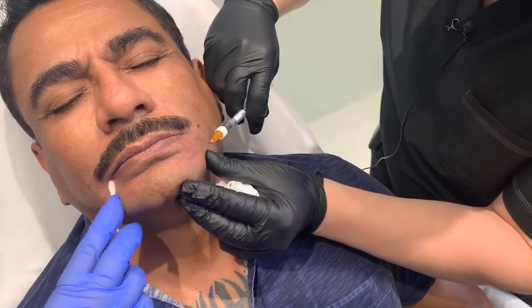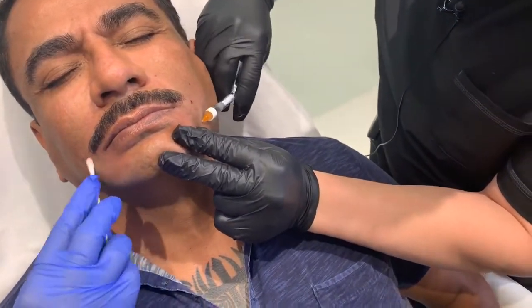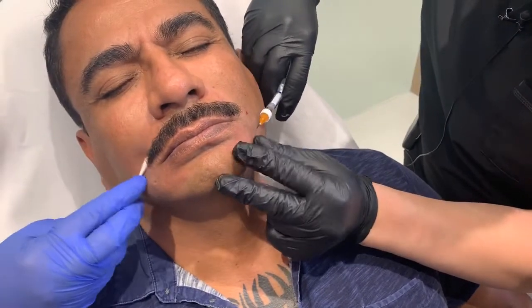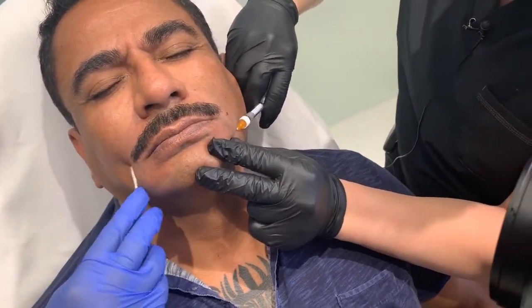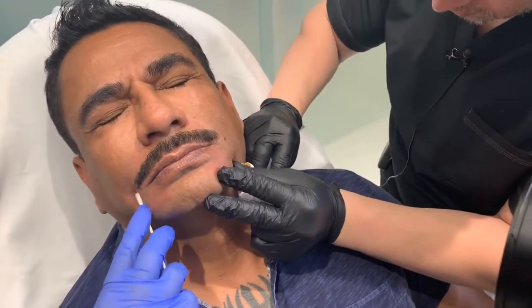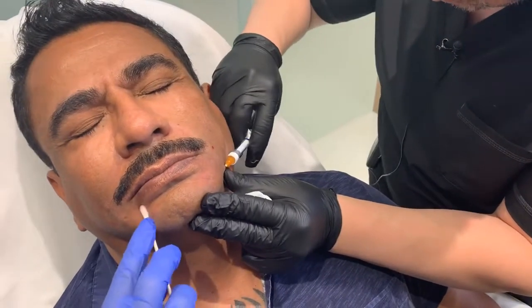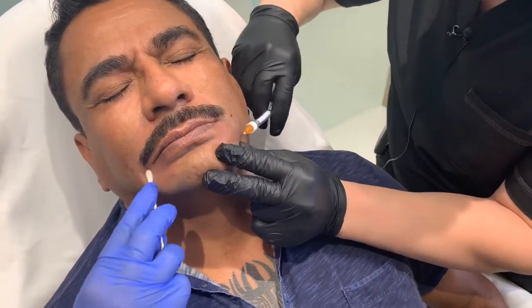Now, he does have laxity, you guys, and remember, fillers cannot be used to improve laxity, so we need to do a lift at some point or some sort of skin tightening. But for at least right now, this is going to give him some support around the fold that he's looking for. Okay.